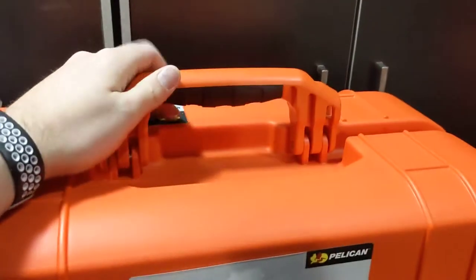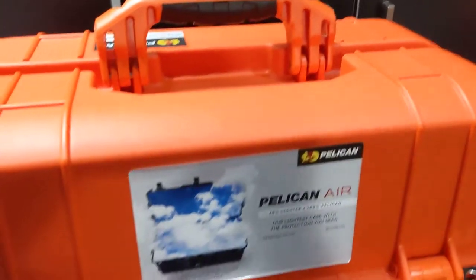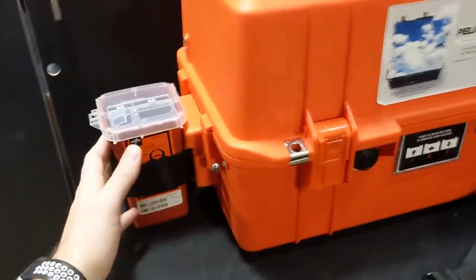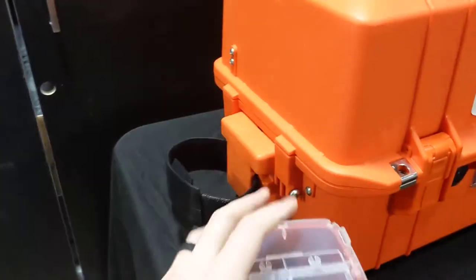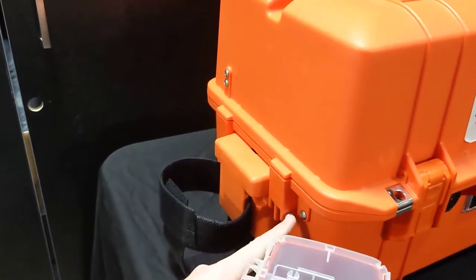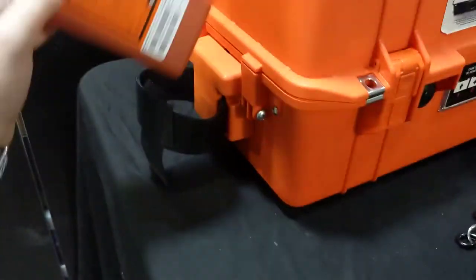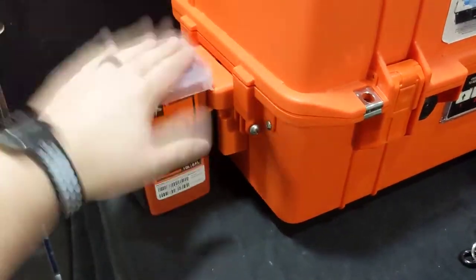On the top you've got a carry handle, and it also comes with two additional carry handles that you can attach on either side. The sharps container holder is also removable — the bolts just come out with a simple screwdriver and the whole piece drops out. You can put a handle in there or leave it empty, but the sharps container is a nice addition.